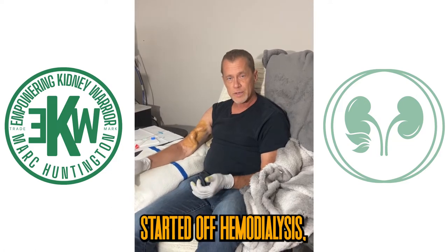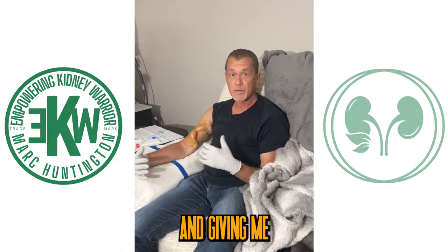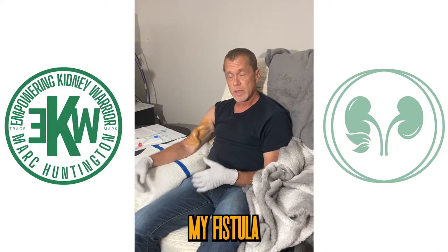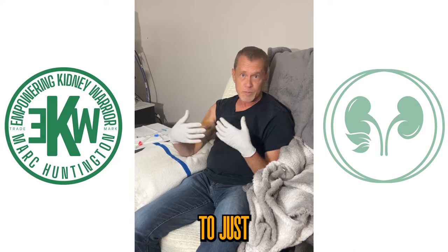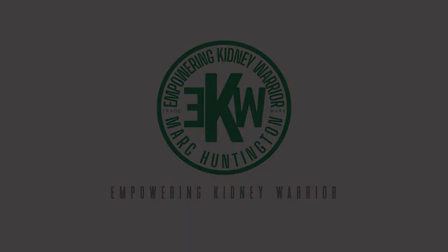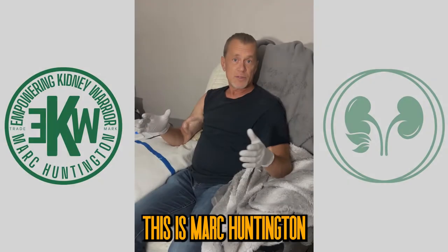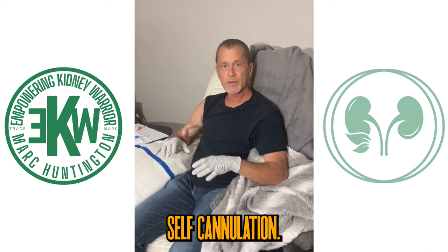When I very first started off hemodialysis, I had a bad experience with the tech sticking me and giving me a bad stick. It caused problems that almost caused an infection in my fistula. At that point, I realized this is my lifeline, and I did not want other people to just stab at it. This is Mark Huntington with Empower Kidney Warriors, and in this video, I'm going to demonstrate self-cannulation.